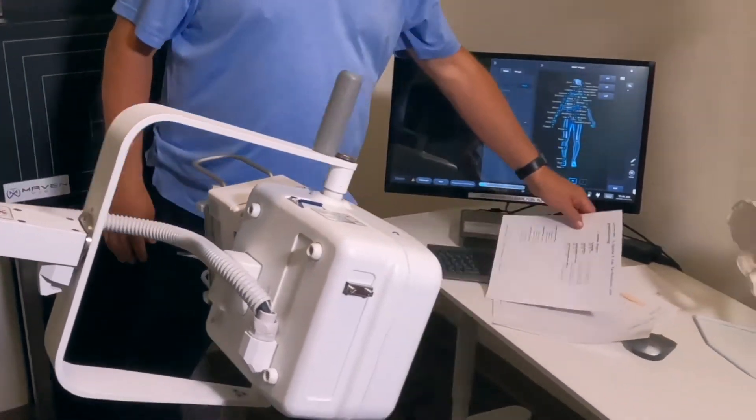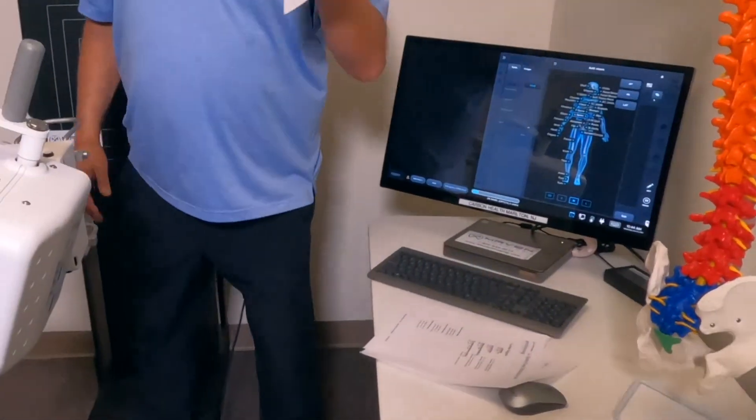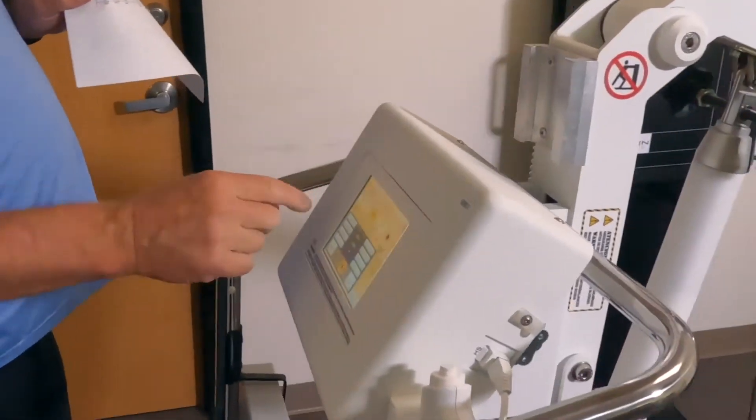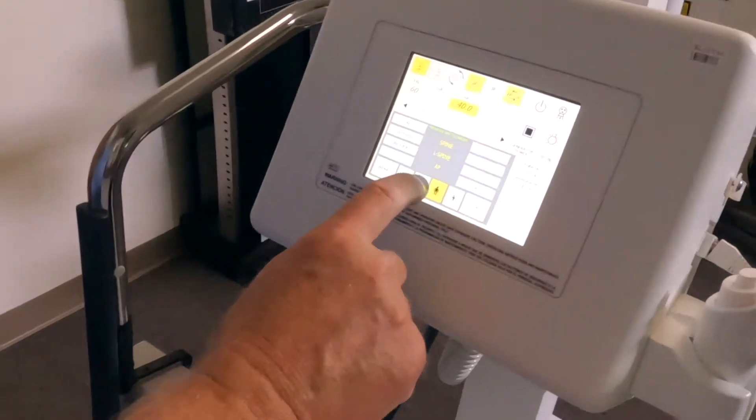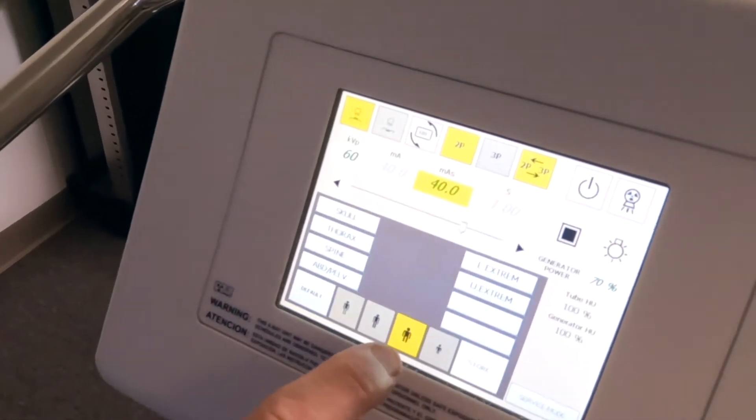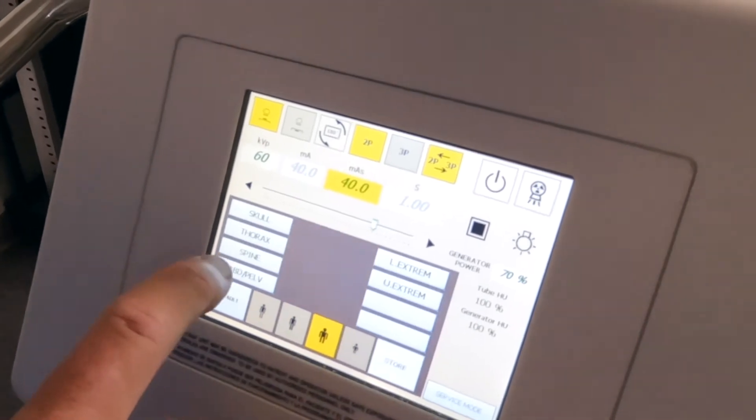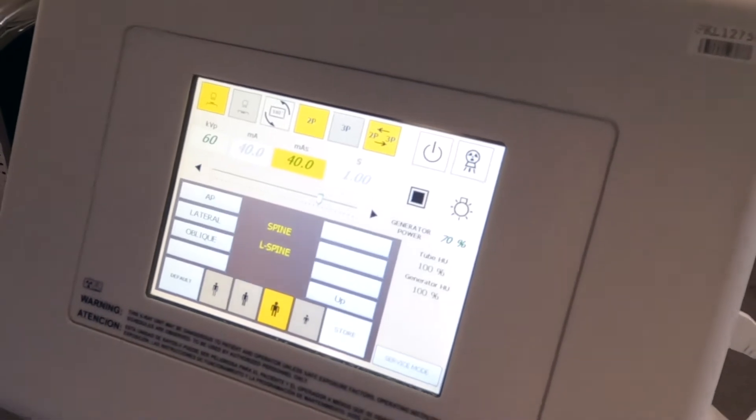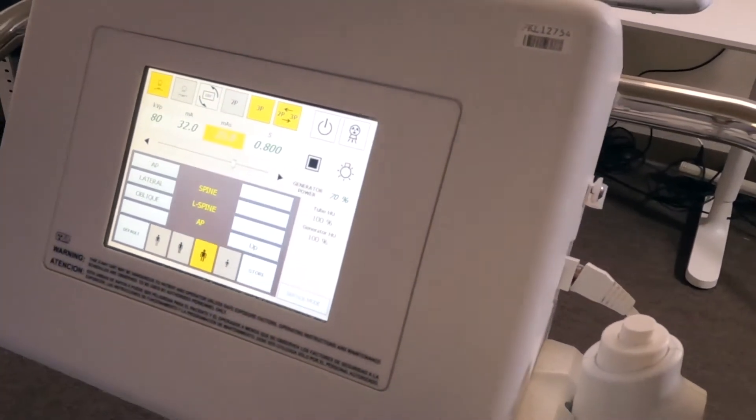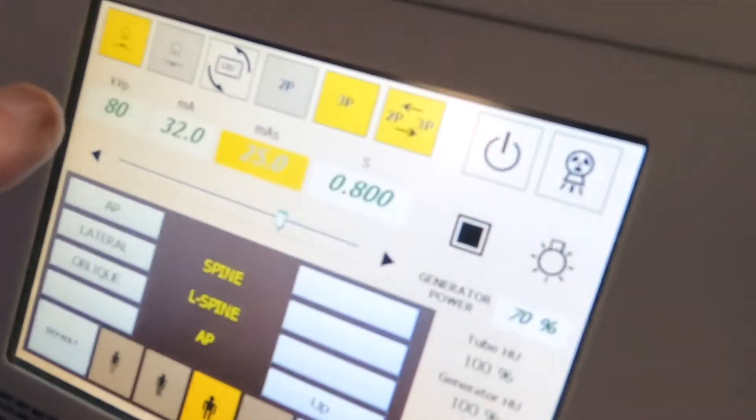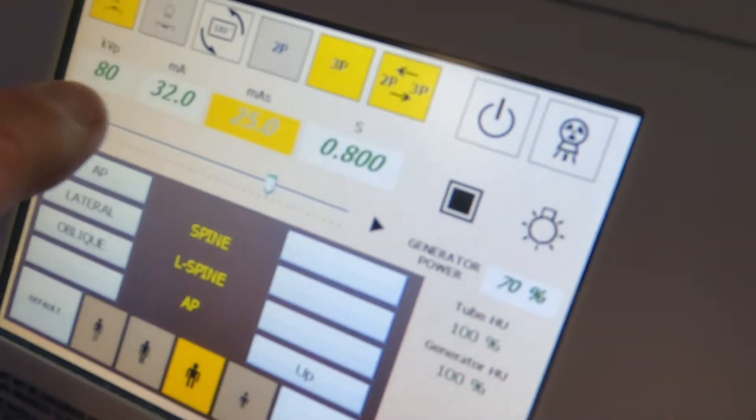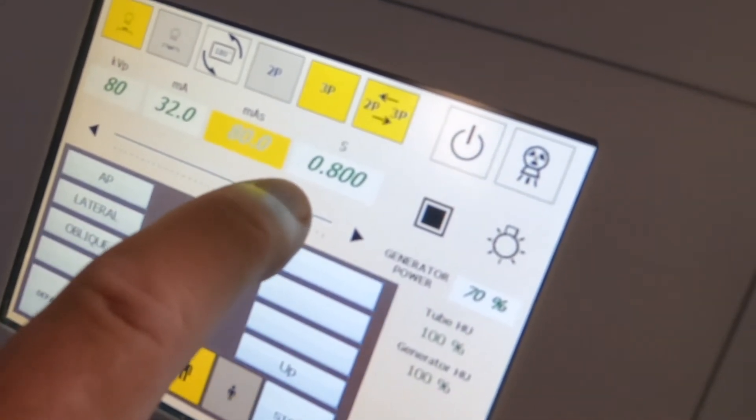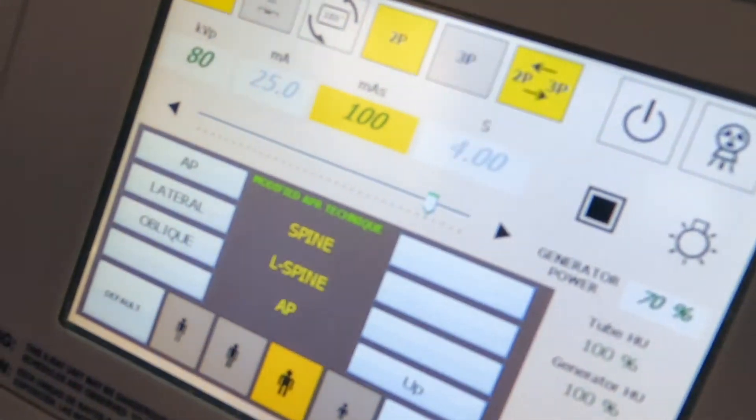The next thing is we have a technique chart. We're going to do a new shot, select the large focal point because I'm over 250 pounds. We're going to hit L-spine and then AP. As you see, we have KVP set at 80.